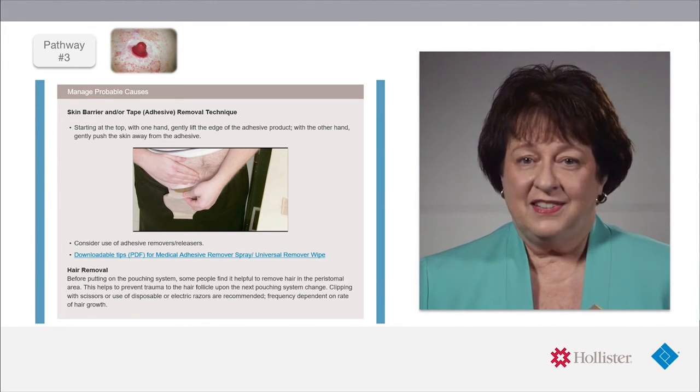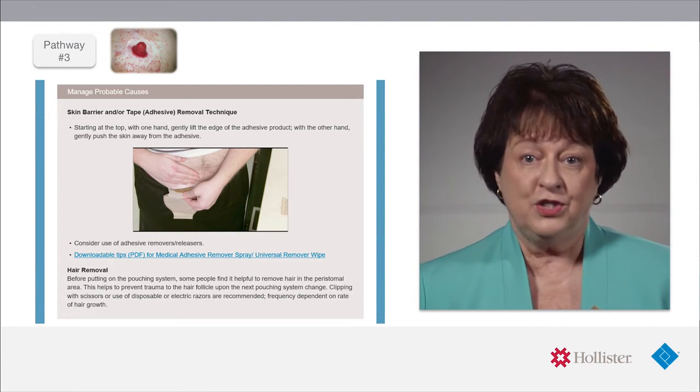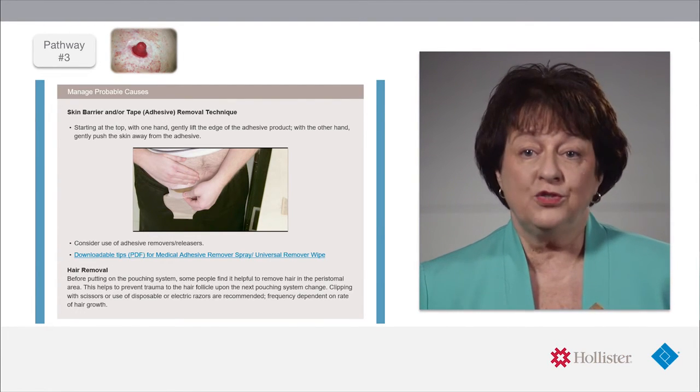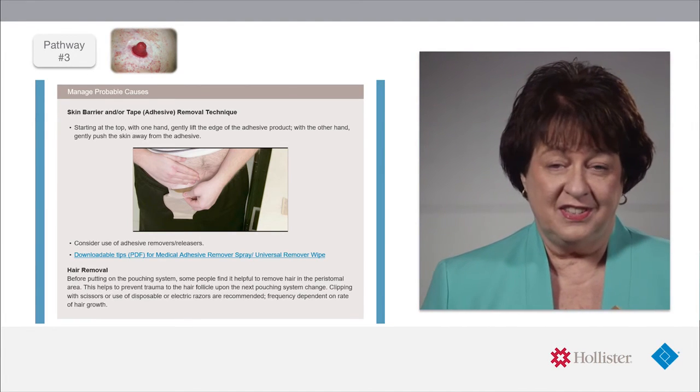Second, the guide advises that removing the hair in our peristomal area prior to putting on our pouching system might be helpful to prevent trauma to the hair follicles, and advises some hair removal suggestions.